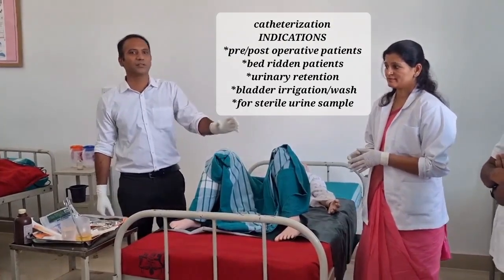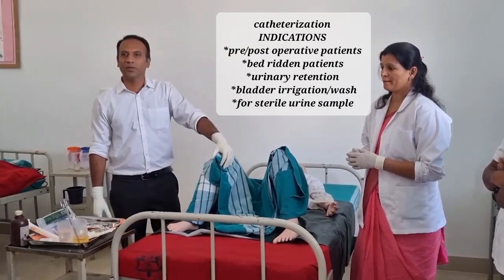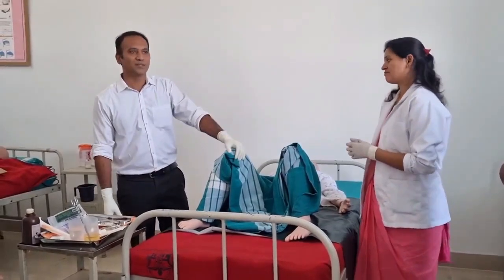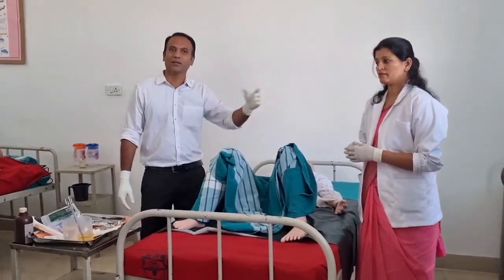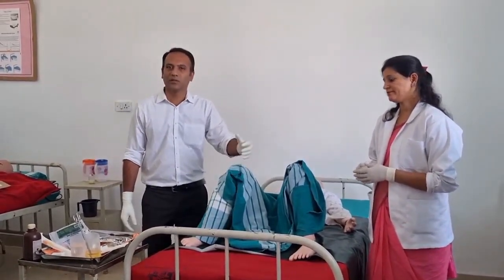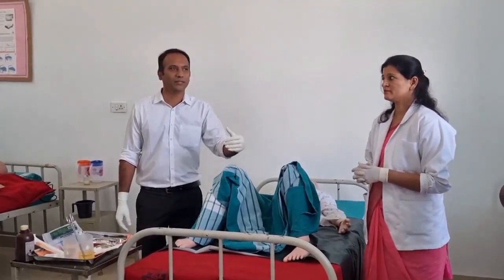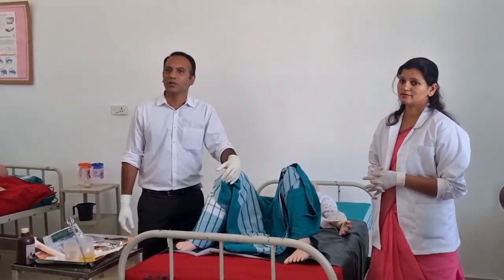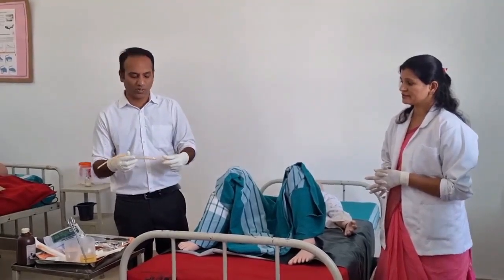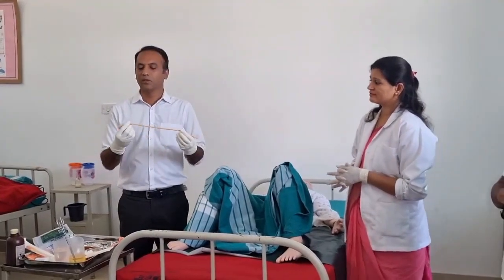Today we are going to demonstrate the female catheterization procedure. I understand this is a laboratory demonstration, a kind of simulation lab, and there are some prerequisites for this, for example a side screen. Assuming that we have a side screen, we are going to carry out this procedure. Catheterization is a procedure wherein we insert a rubber catheter. Mainly, we are using a Foley catheter. This is unsterile, just for demo purposes. This is known as a Foley catheter.